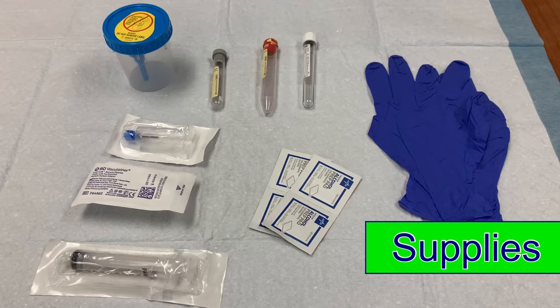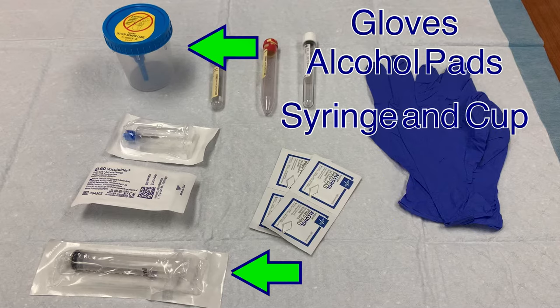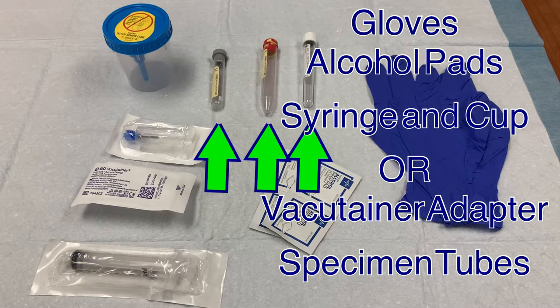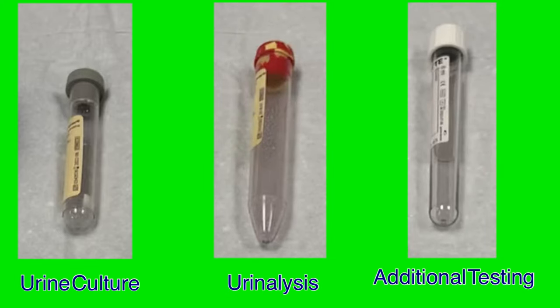In order to collect this sample, the proper supplies will need to be gathered. You will need clean gloves, alcohol prep pads, and depending on the method used, either an empty syringe and a collection cup, or a vacutainer adapter, and the three urine specimen tubes: the gray top tube for urine culture, the marble top for urinalysis, and the white top for any additional testing that may be ordered.